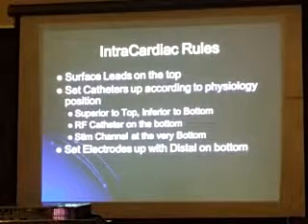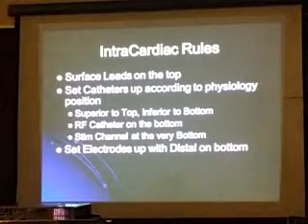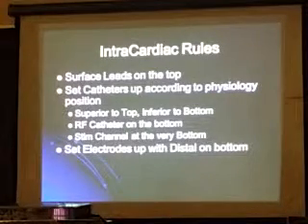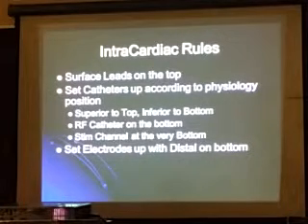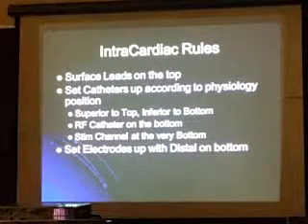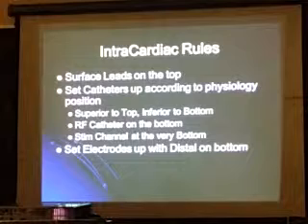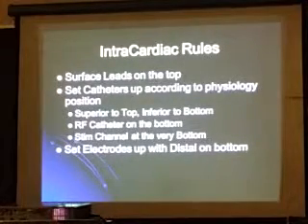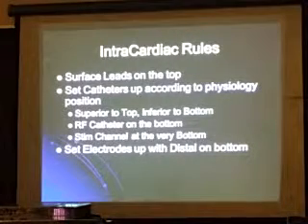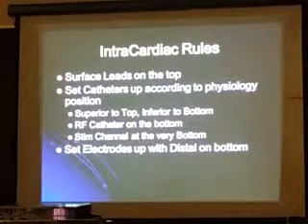We always set up, except for one group out of New York, and I run into their doctors every once in a while, with the distal electrode on the bottom. So when you're looking at it, it should go 1, 2, 3, 4, 5, 6, 7, 8, 9, 10. But there are 1 or 2 schools out there whose doctors like to flip those. It's really annoying when I go to those places because I can never figure out what's going on. I'll say something, and they'll be like, haha, no, it's really this, because I'm looking at everything upside down.